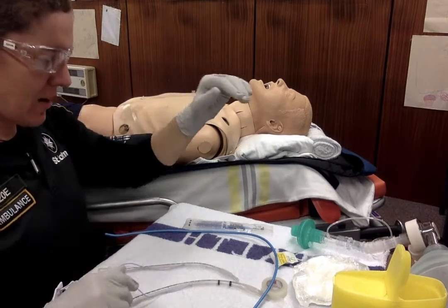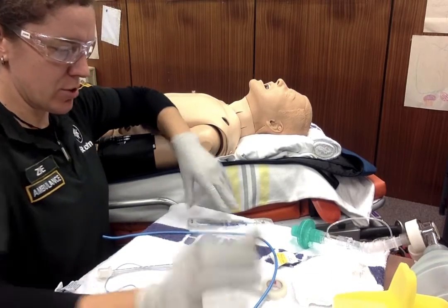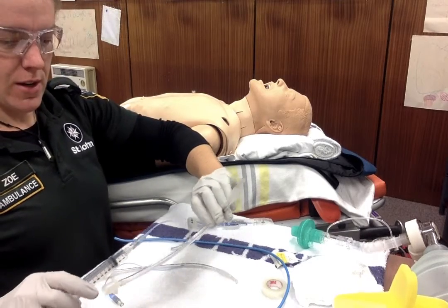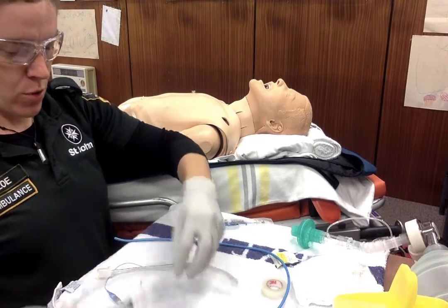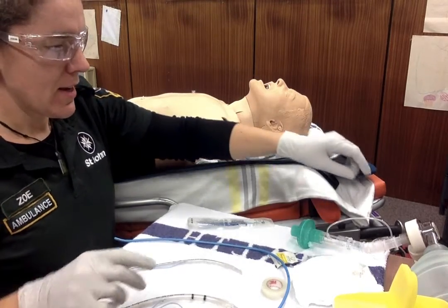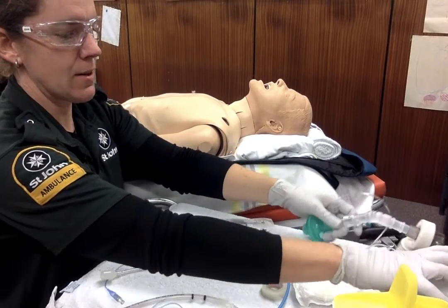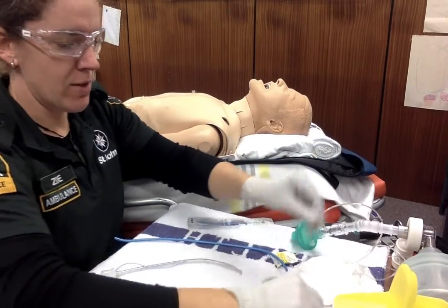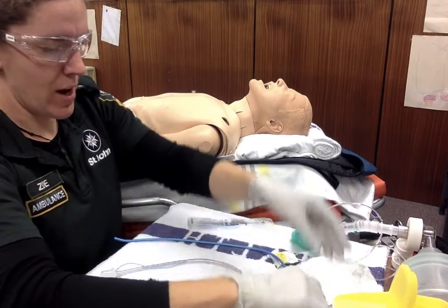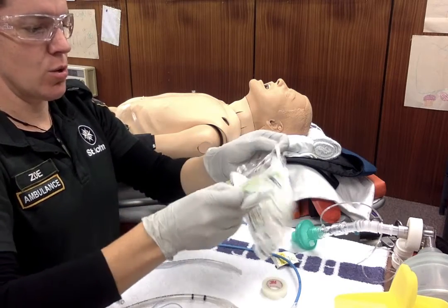PPE, glasses and gloves. I've got a scalpel here ready and a sharp container for it to go into. I've got my bougie. I've got a size 6 tube and I've checked the cuff. I've also got a size 5 just in case I get in there and realise there's not a lot of space. I've got my bag mask all ready and set up. I've got my capnography plugged in, my filter, and I've also got some gauze here to try and help mop up the mess, if there is any, and a way to secure the tube.